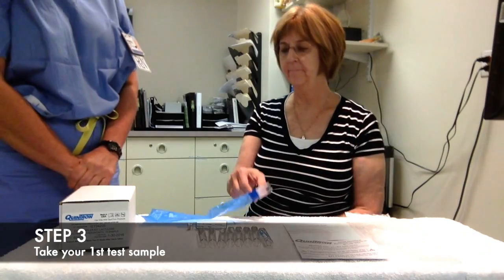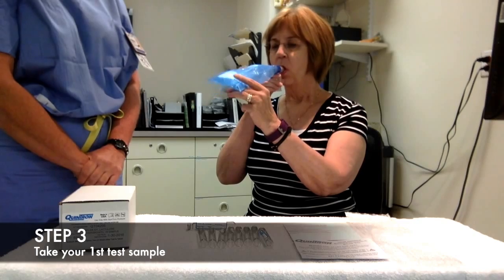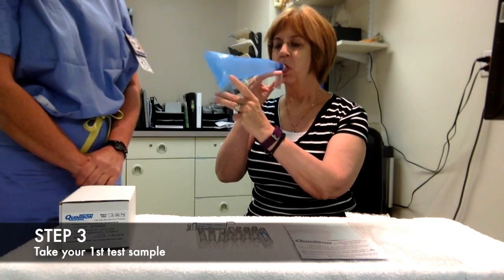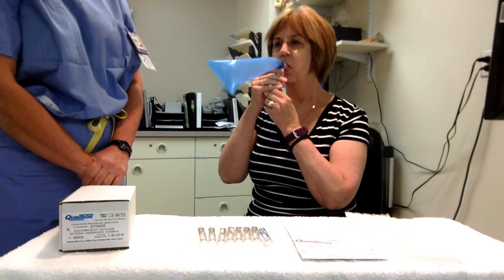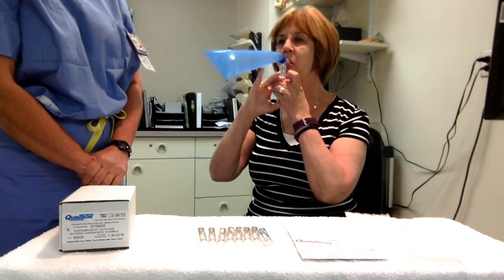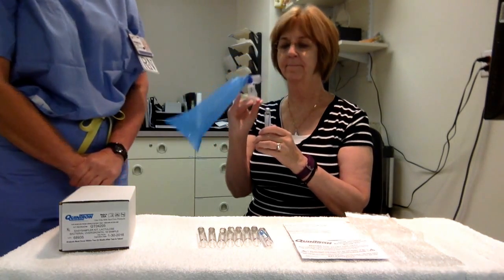Let's go ahead and try that one more time here with the sample. Take a breath in, slowly blow out to the bag, take your tube that's already labeled with your time and your date, puncture that, keep breathing out the whole time. Count one, two — take the tube out, then take the device out of your mouth.